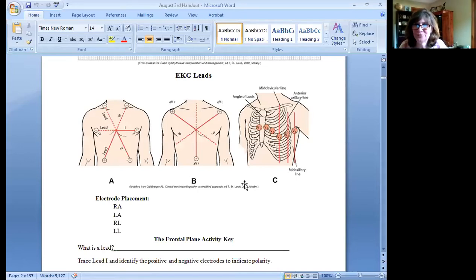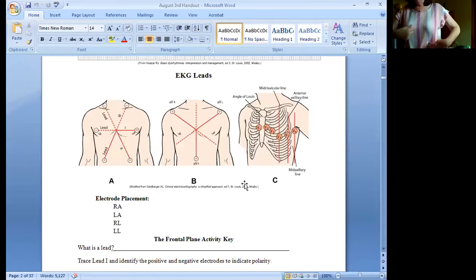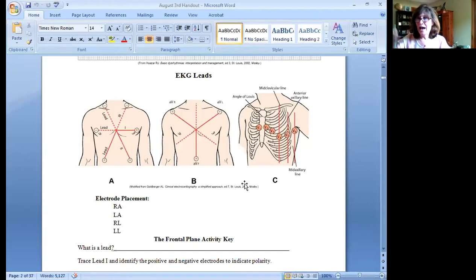But if you want to have fun at work, you're going to learn this stuff. By virtue of me putting on electrodes, I wish I had some electrodes here. I apologize that I don't, but when real class rolls around, I'm going to have some. I'm going to put an electrode on my right shoulder, my right chest here, one on the left, one right here, and then one smack in the middle. By putting those 5 EKG patches on the chest, I can tell the monitor, look at lead 1, look at lead 2, look at lead 3, look at AVL, look at V1.